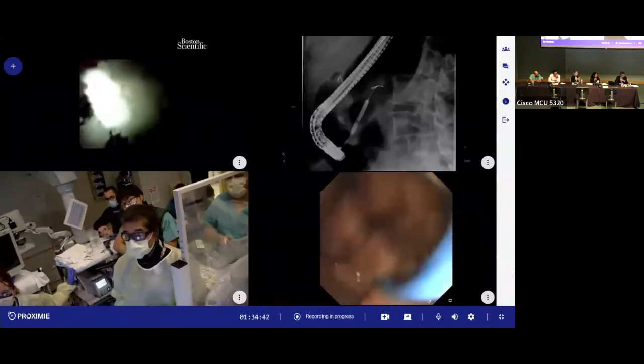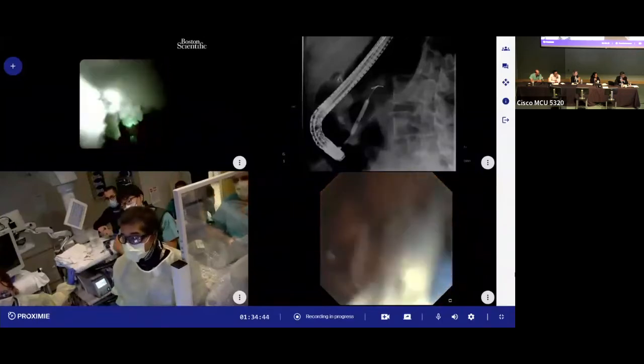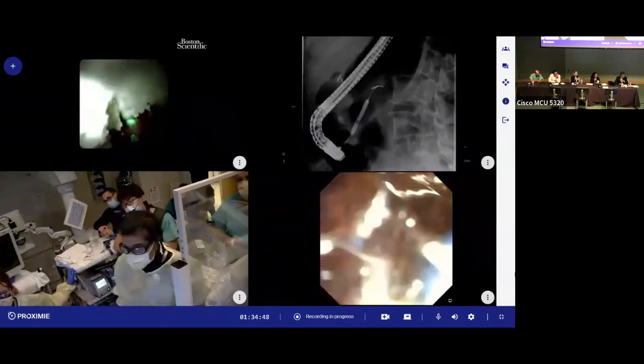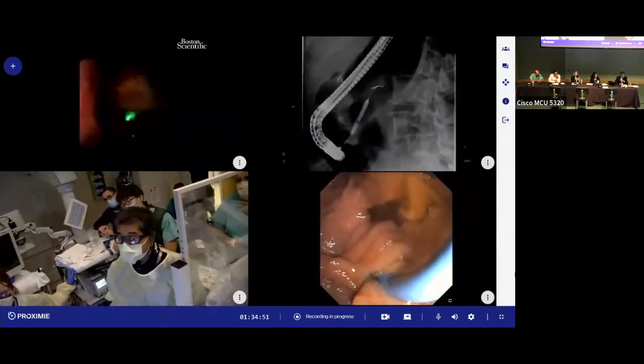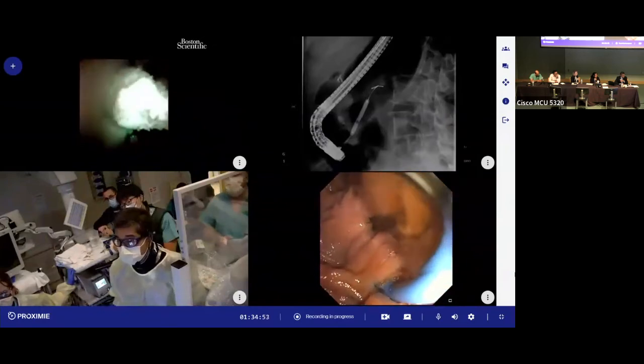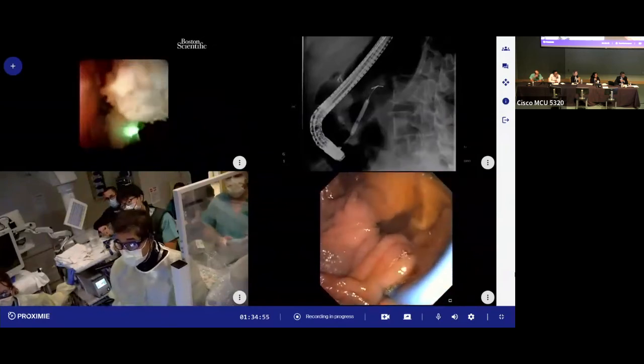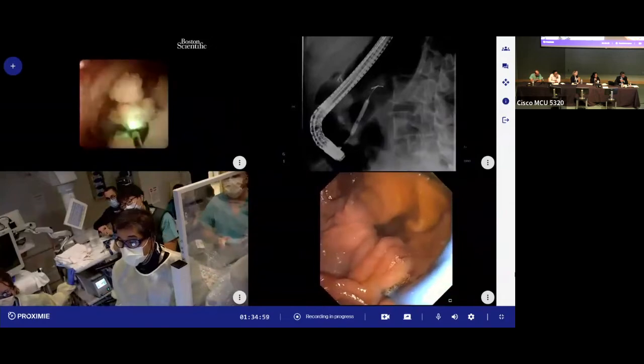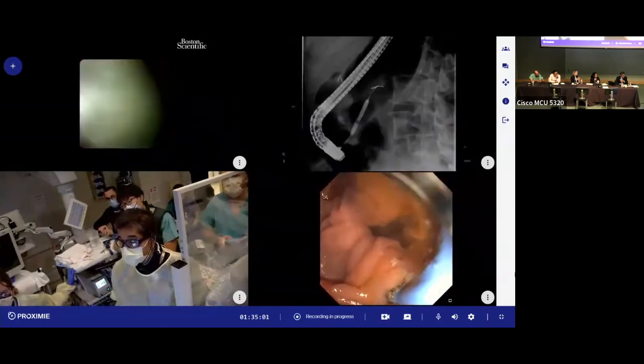No risk to the patient, but there is some data from Sandeep Patel. I think, Sam, you're working on getting that published. Sandeep Patel from UT San Antonio. There's an animal model, porcine model, looking at how much laser you can apply to a porcine bile duct without causing perforation.